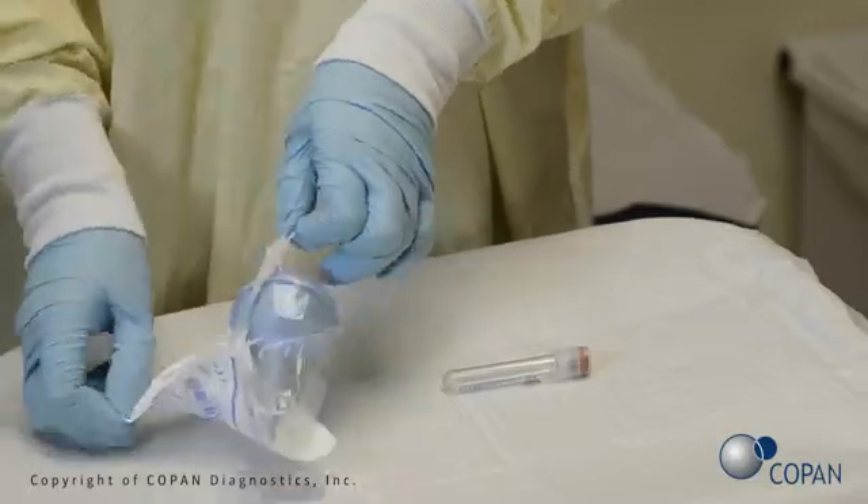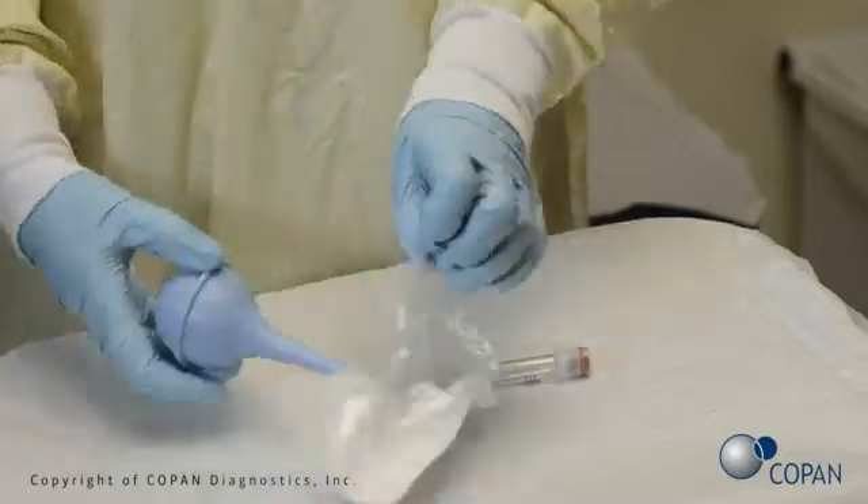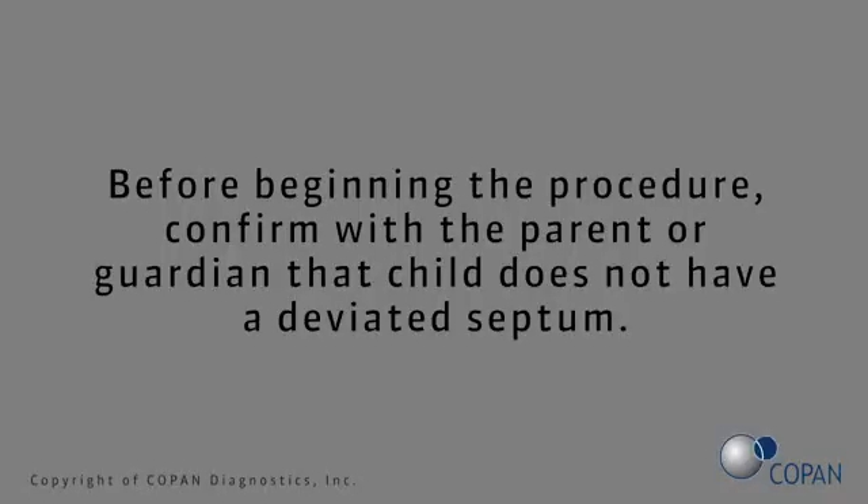Open the sterile bulb package. Before beginning the procedure, confirm with the parent or guardian that the child does not have a deviated septum.